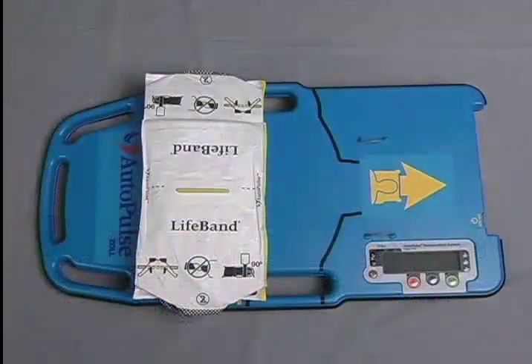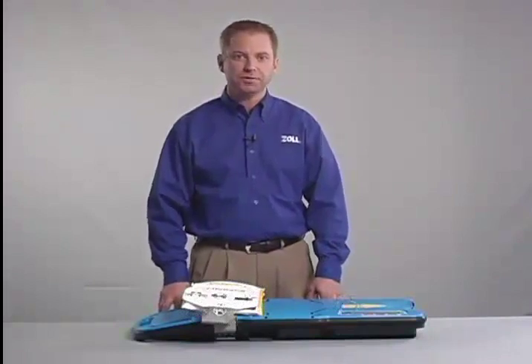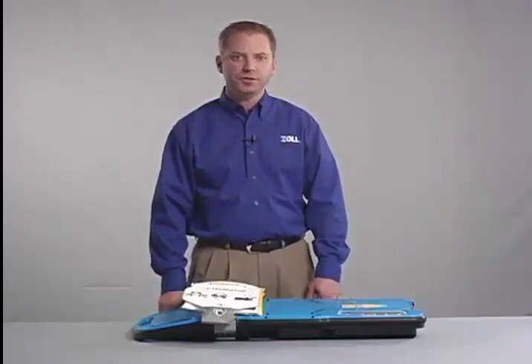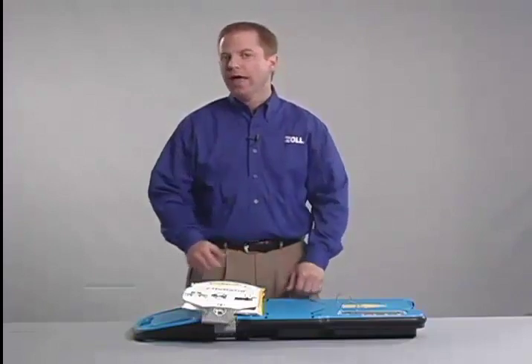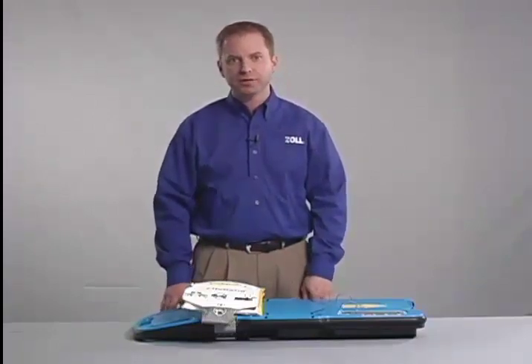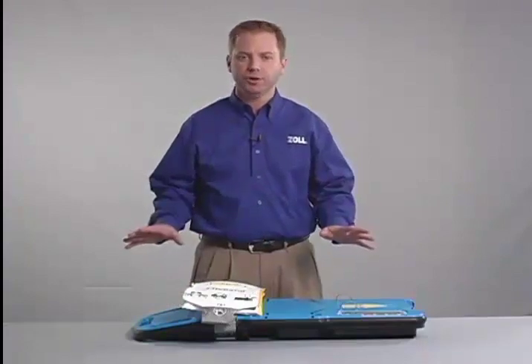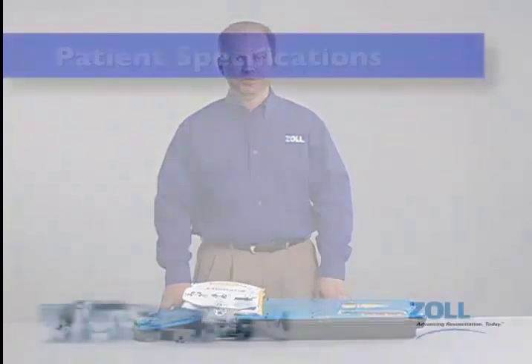The Autopulse's load-distributing lifeband is integral to the device's unique ability to improve blood flow and lessen the possibility of CPR-related injuries. The lifeband takes the force that is normally applied to one small area under the hands during manual CPR, or at the end of a piston with pneumatic-driven devices, and spreads that force over a much wider surface area of the chest. The lifeband can accommodate the following patient specifications.